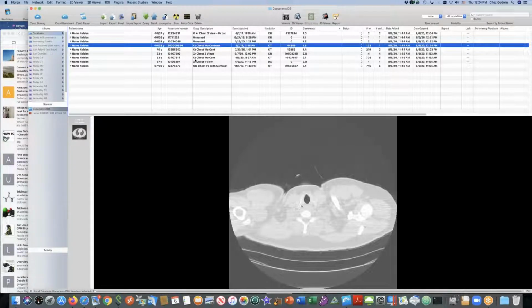That's terrible. That's got to be the fastest progression. The guy has been removed from the fabrication floor, and he now has an administrative job. But as you can see, once the silica was deposited in the lung, even with withdrawal of exposure, the lung disease is ongoing. It's very fibrogenic.